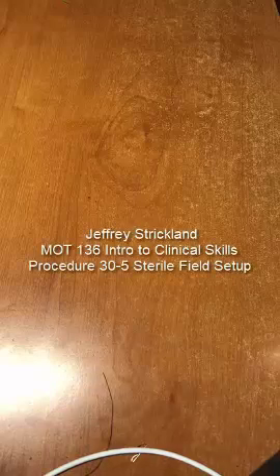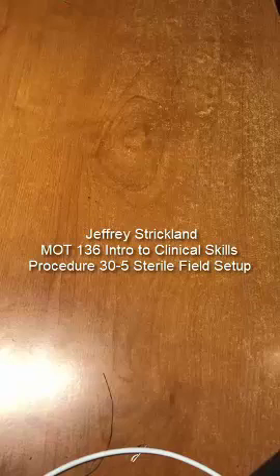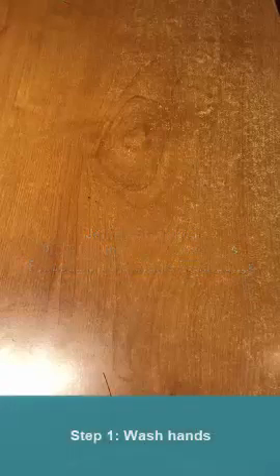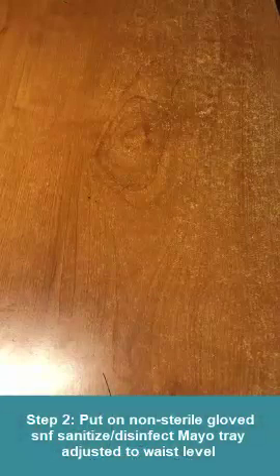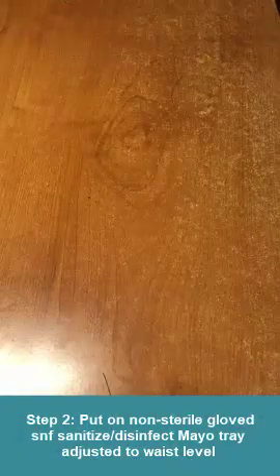This is procedure 30-5, setting up a sterile field with instruments. So the first thing I've done is I've washed my hands and I've put on non-sterile gloves so I can check the equipment and also clean the surfaces I'm going to be working on.